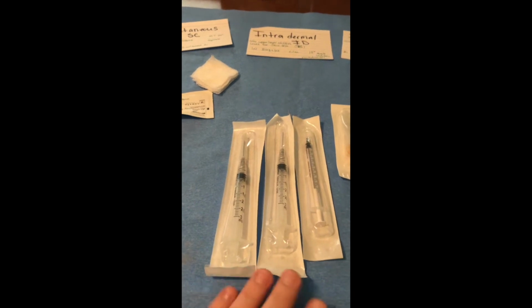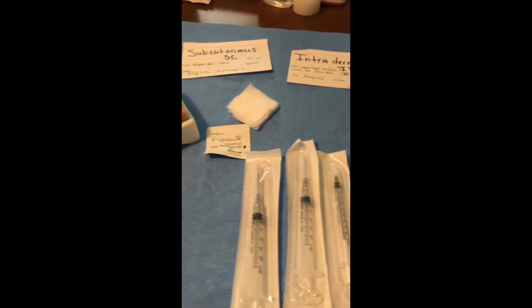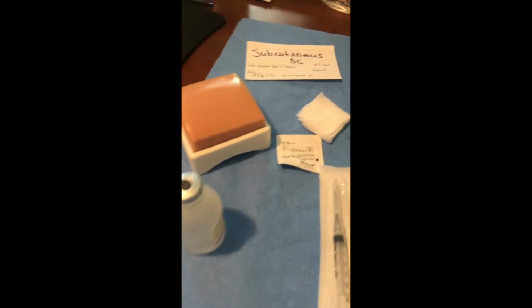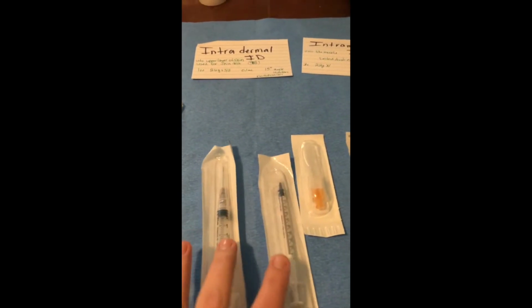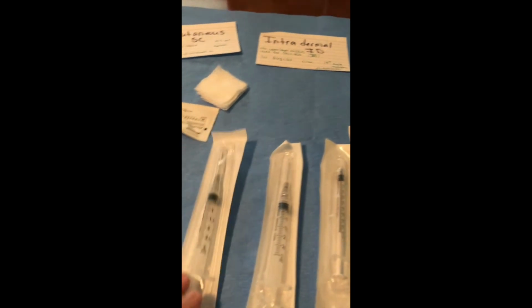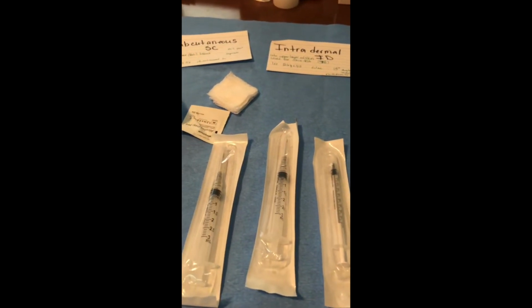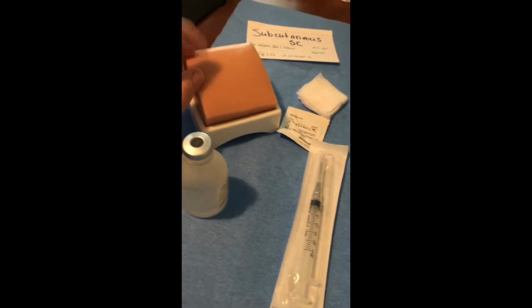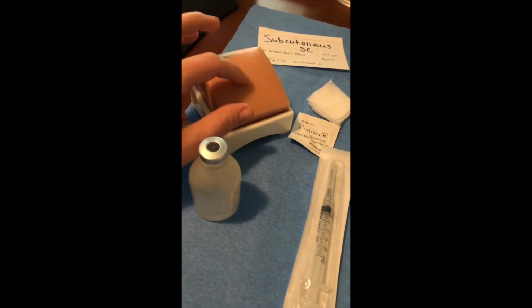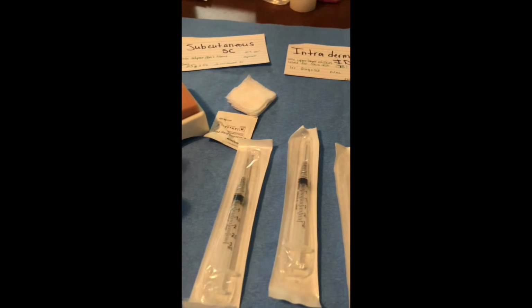Today we're going to be talking about injections. I have 3 different injections that I'm going to show you how to do: subcutaneous, intradermal, and intramuscular. So that's going to be 3 different demonstrations. I've got 3 separate needles, 3 separate syringes, and I have my little skin simulator here because I'm not going to stick anybody today.